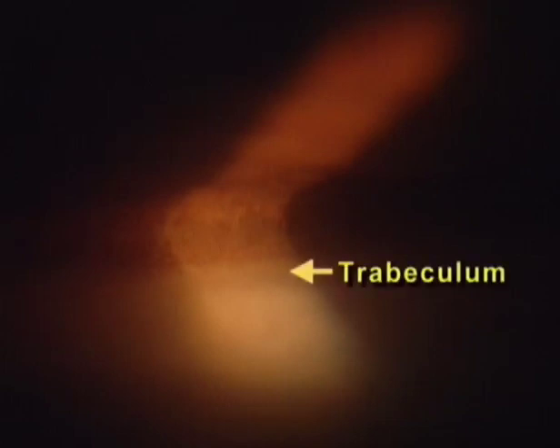This case of congenital glaucoma looks normal at first glance. However, when looking more closely, we find tissue strands extending far up the trabeculum. And here are extremely fine cobwebs, extending even further over Schwalbe's line into the cornea, and this can be made out more clearly when observed in retroillumination against a narrow light slit.